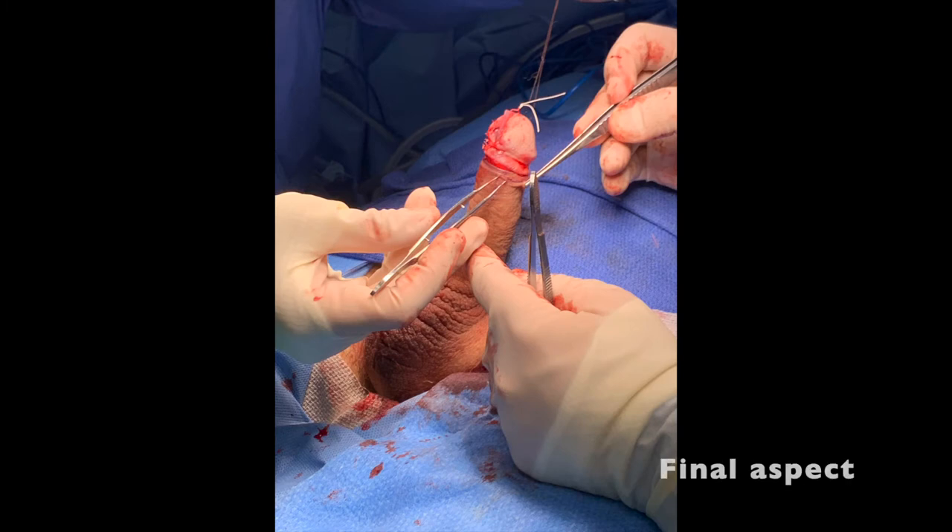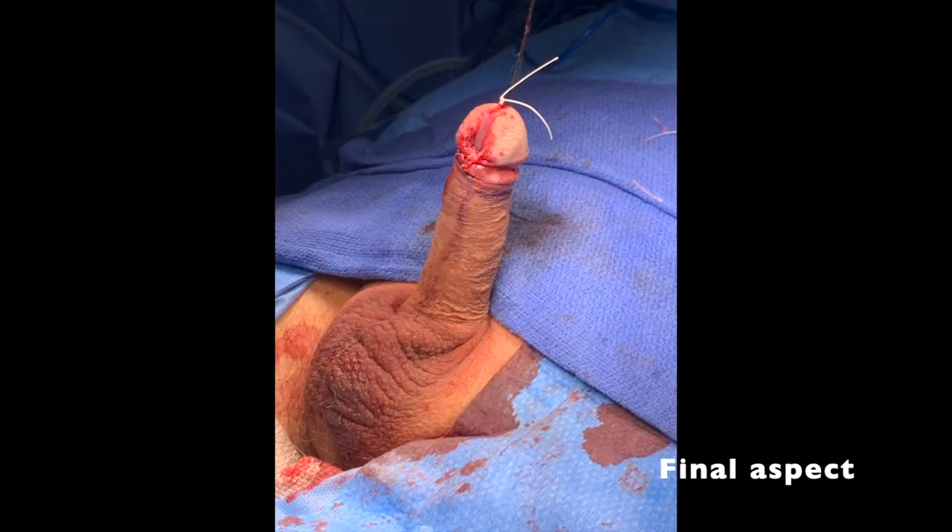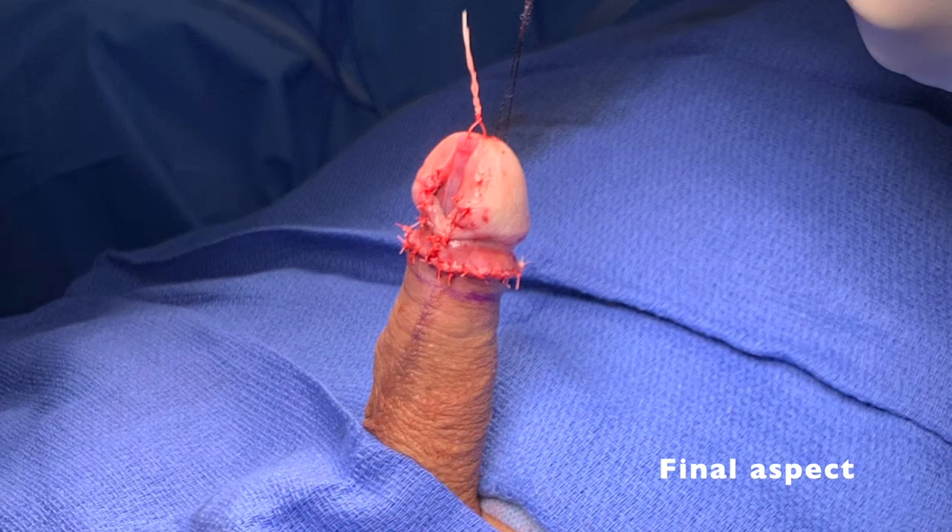The circumcising incision was then re-approximated with skin-to-skin anastomosis using 5-0 vicryl interrupted sutures. The incision was then dressed with a clear film such as Tegaderm.